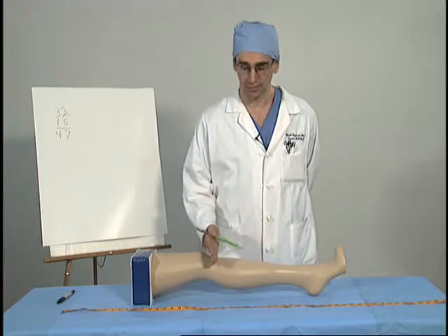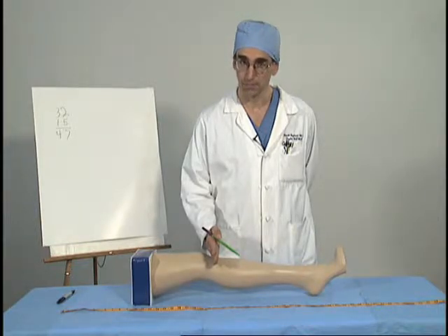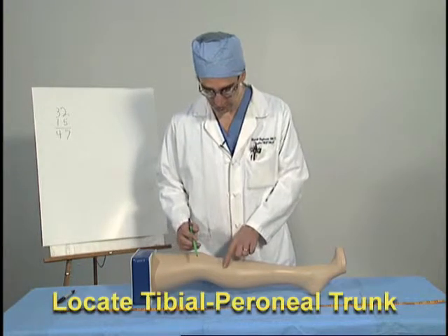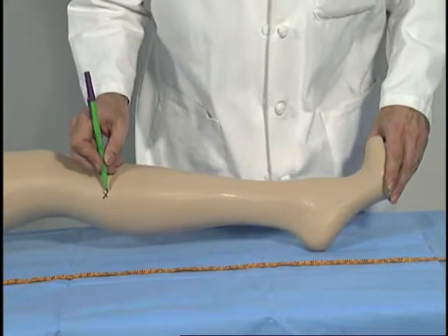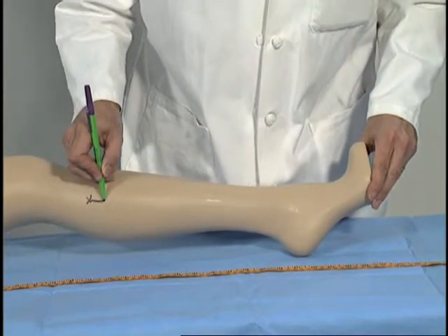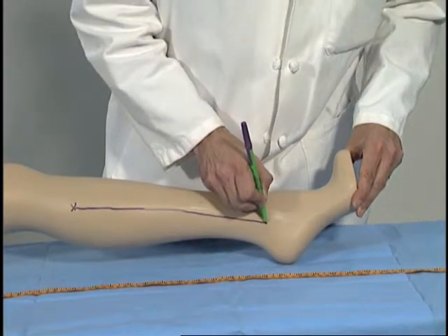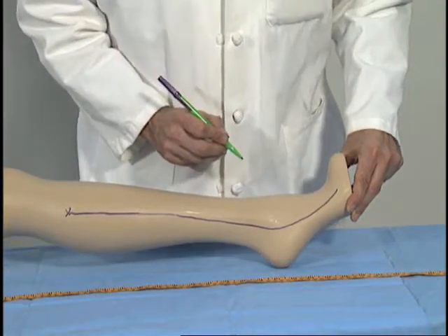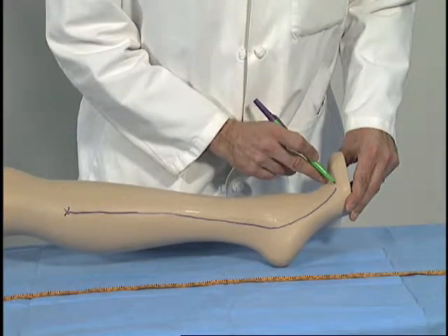Again, we have adequate inflow to the level of the tibial-peroneal trunk, but this time all three of the tibial vessels are occluded with no visible reconstitution below. Therefore, we would again visualize the tibial-peroneal trunk as in the right leg. You will then extend, as we previously did, our line for injection along the medial plane, generally 2 to 4 centimeters posterior to the edge of the tibia, as you would do for a medial approach to the posterior tibial or peroneal vessels. We'll extend this behind the ankle and onto the forefoot.